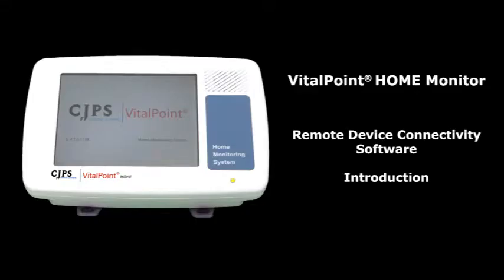The Remote Device Connectivity, or RDC software, allows for customizable communication between patients and their caregiver and is included with every monitor. RDC is a complete electronic medical record system that is used by clinicians to monitor and manage an unlimited number of patients.